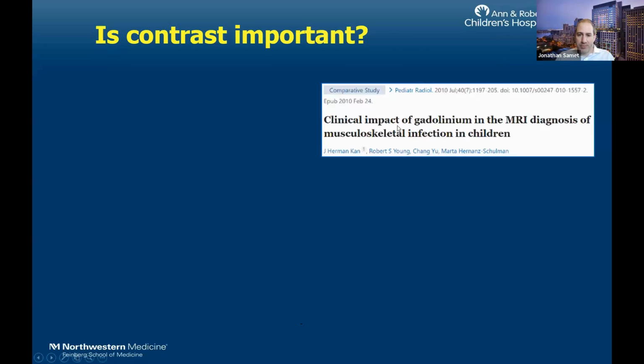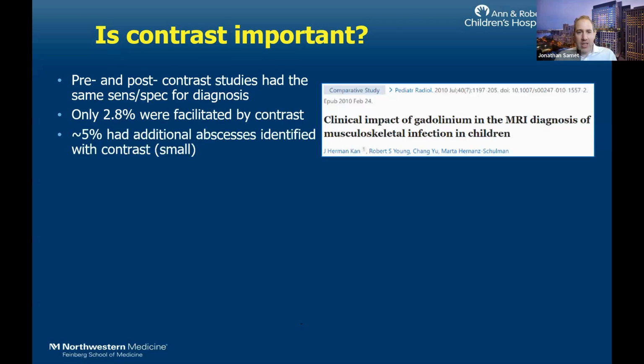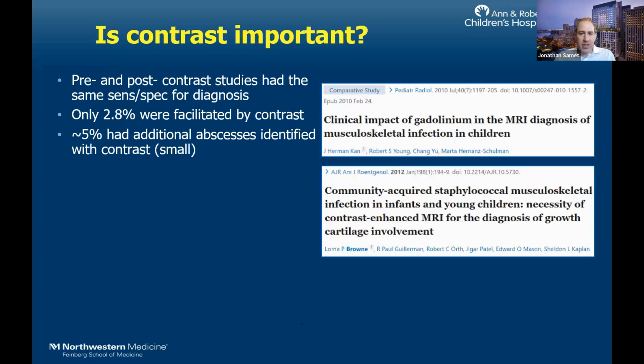I love this article by Dr. Khan, and they looked at the clinical impact of gadolinium for MSK infection. This is Pediatric Radiology 2010. What they did is they looked at pre and post contrast studies, and they tried to see whether it really added value. And they found that it had similar sensitivity and specificity for the diagnosis. They said that really only about 2% of exams were helped by contrast. There were about 5% that had additional abscesses identified if you gave contrast, but they concluded that they were so small that it didn't really matter anyways. So they concluded that you didn't need contrast for infection.